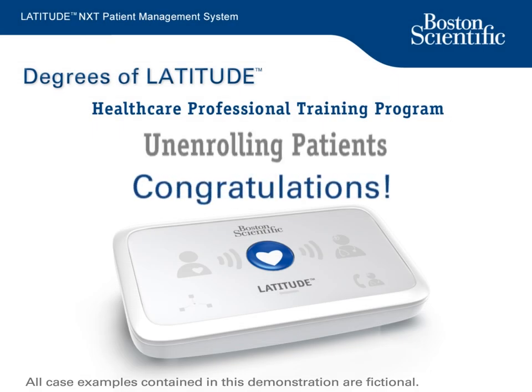Congratulations! You successfully completed the Degrees of Latitude module on unenrolling patients in LATITUDE NXT.